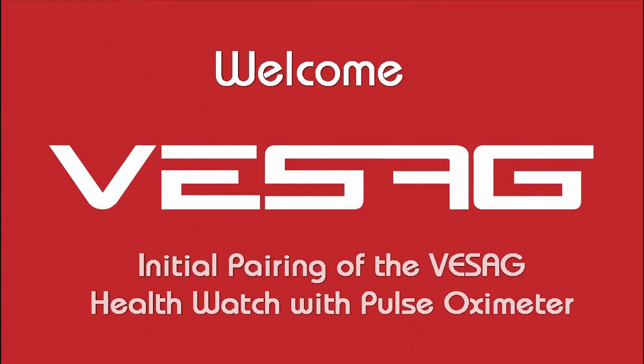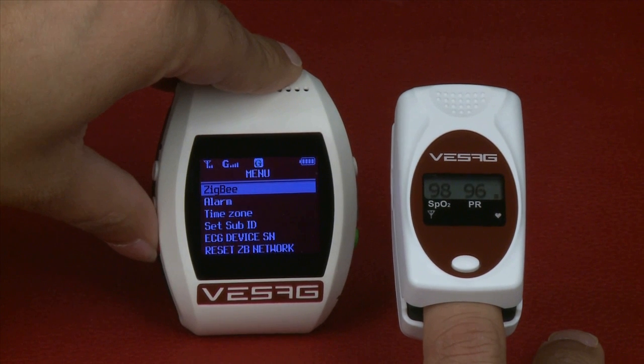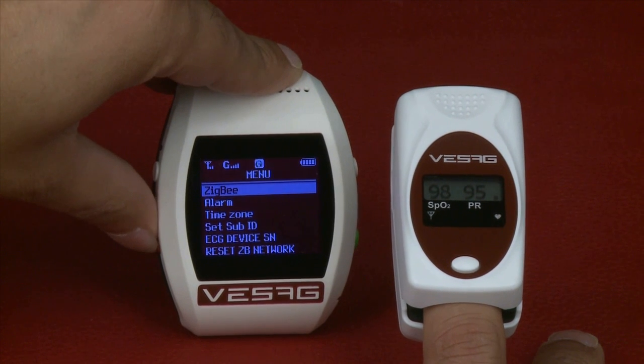Welcome to this tutorial from Visag on the initial pairing of the Visag Health Watch with Pulse Oximeter. This covers how to use and pair Visag with the Pulse Oximeter.